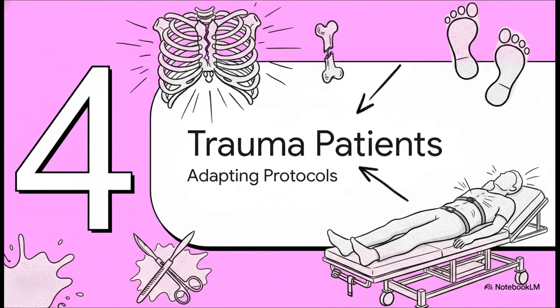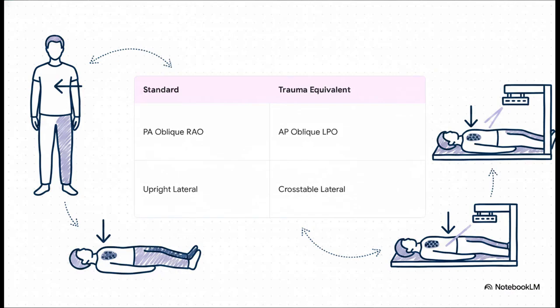Section 4. Adapting for trauma patients. Everything we've discussed assumes your patient can stand up and take deep breaths. In trauma, that's rarely happening. If they're flat on a backboard, you just adapt.